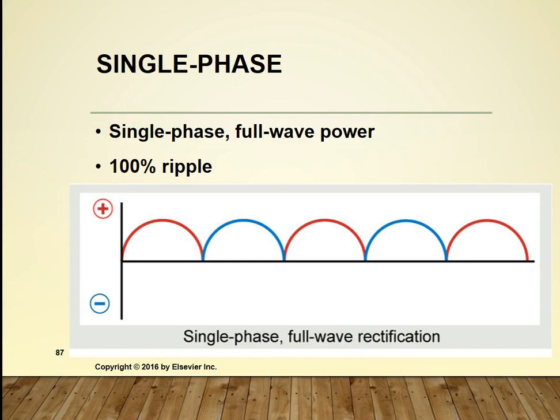What that means is that it's always fluctuating. These are the generators and X-ray machines of the past, and that's why we had to use precise exposure factors. There are not very many of these single phase generators still out there, but this is thrown at you here just so that you understand.